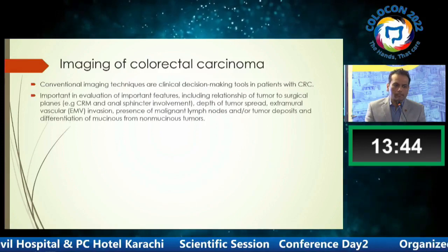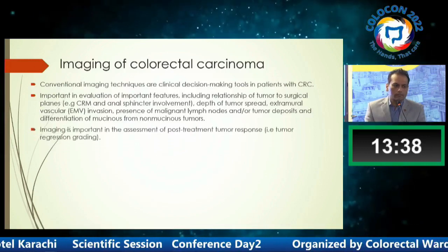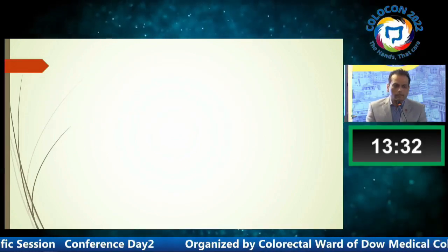Conventional imaging techniques are decision-making tools in patients with colorectal cancer. Imaging is important in assessment of post-treatment tumor response, that is tumor regression grading.